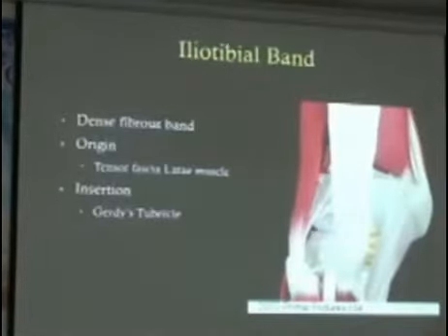So we have a look at the iliotibial band, and that's a dense fibrous band which actually starts up quite high on the hip and then inserts all the way down onto Gerdy's tubercle.